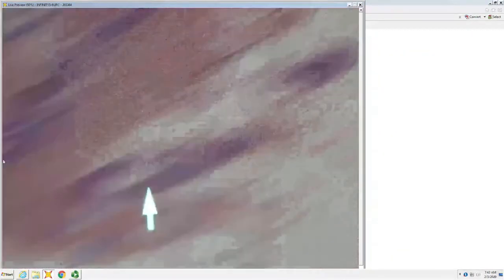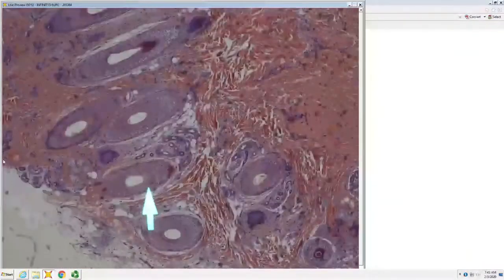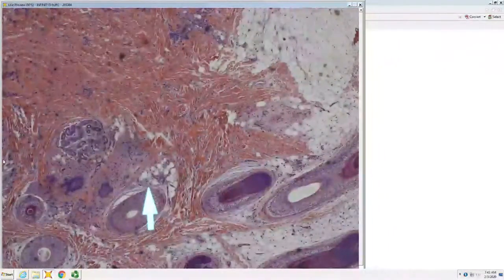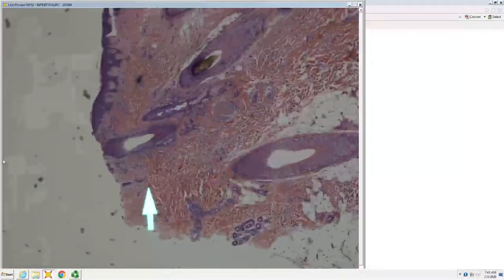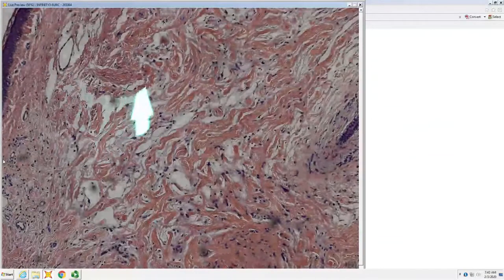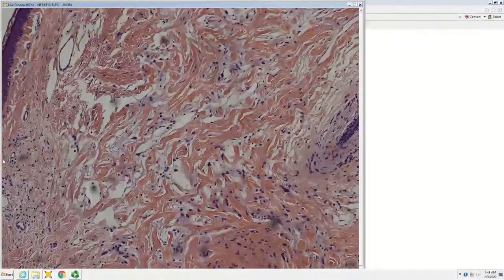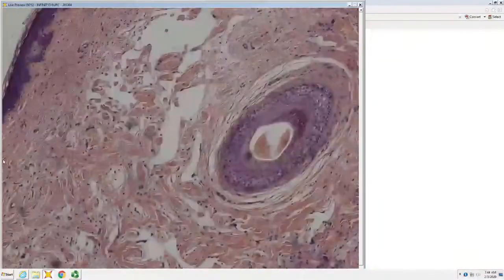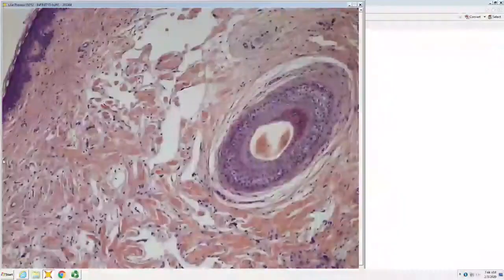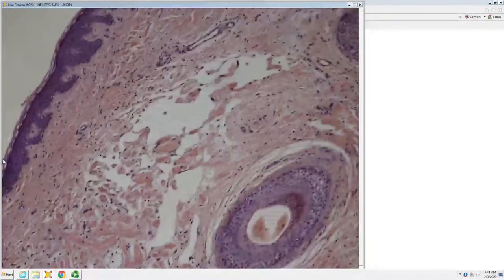Okay, so first thing is, how old is this patient? Look how bright red that collagen is. So bright red, small collagen is kid skin. And then within this kid skin, you have something that almost looks like angiosarcoma, right? It is cracking spaces all through that kid's skin. So how often do kids get angiosarcoma, first off? Not very common. That tends to be an old man tumor, right?